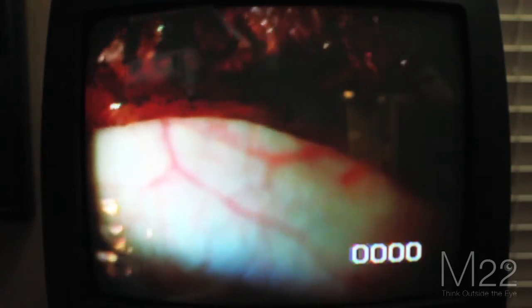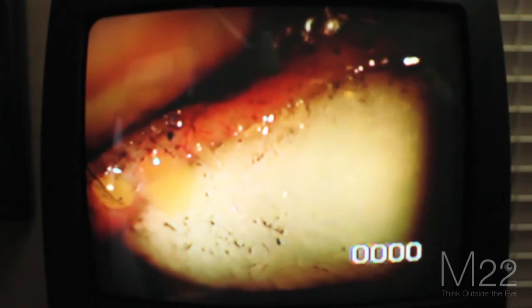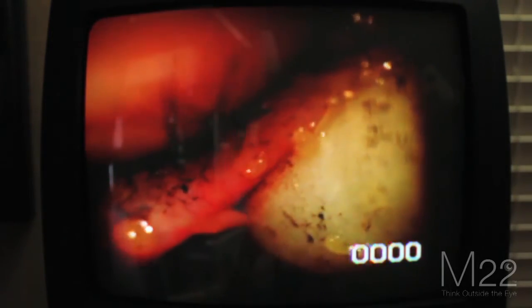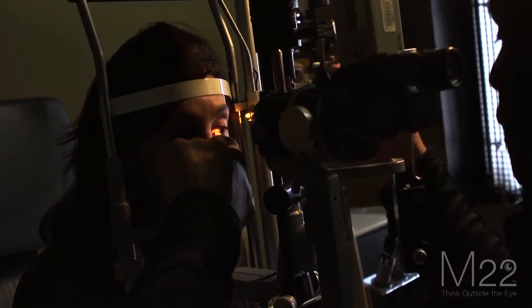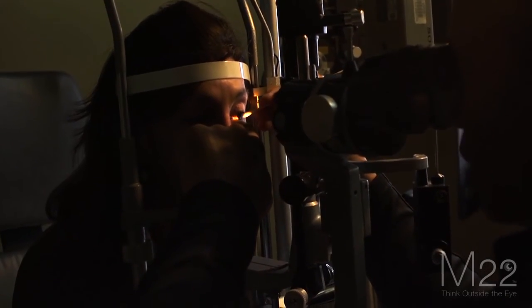I'm pretty vigorous on the first treatment because I want to get as much of this toothpaste-like secretion out as possible. You can see all that toothpaste in the glands — that's completely abnormal. You can see why she suffers from dry eye. All that toothpaste is coming onto my Q-tip. When you're doing this part, patients are going to want to blow their nose because all this abnormal secretion is draining into their nasal passage.